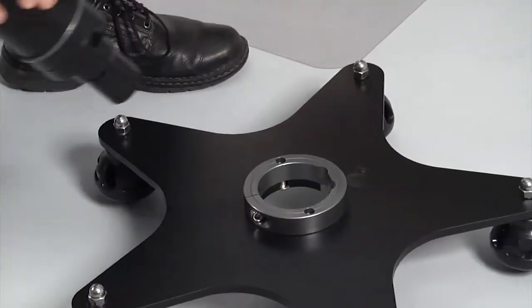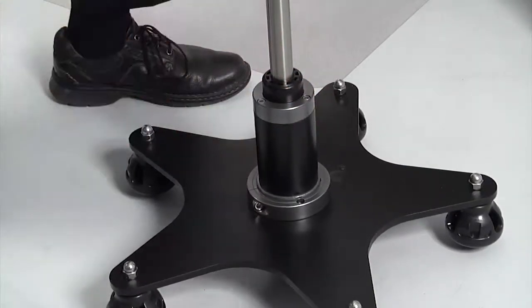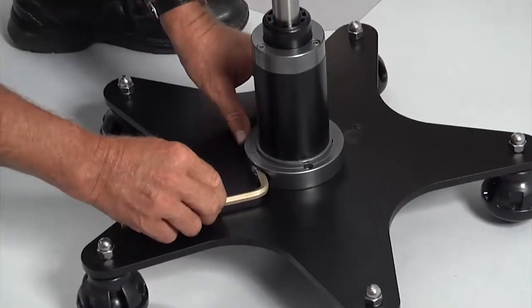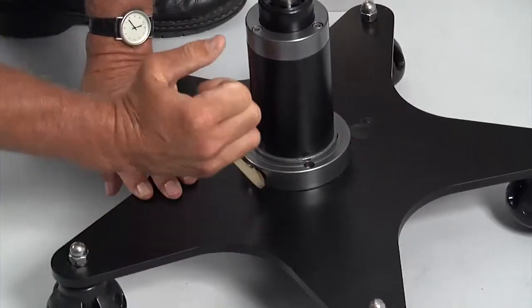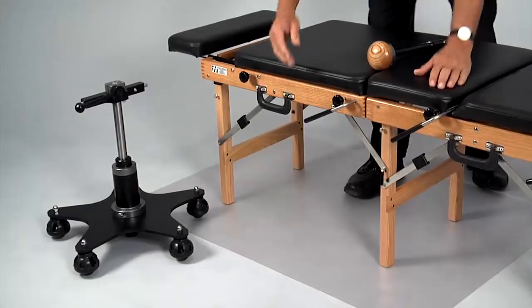Use the allen wrench to lock it into place. You'll attach the control knob and mast after the device is attached to the table.